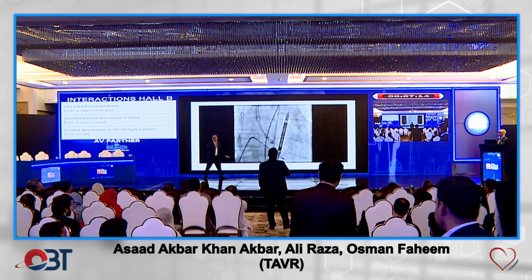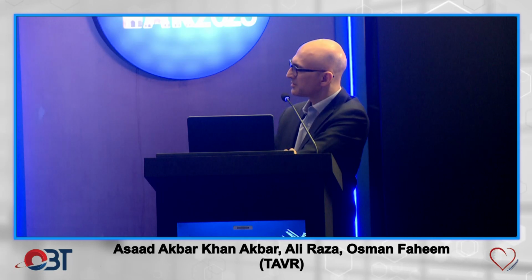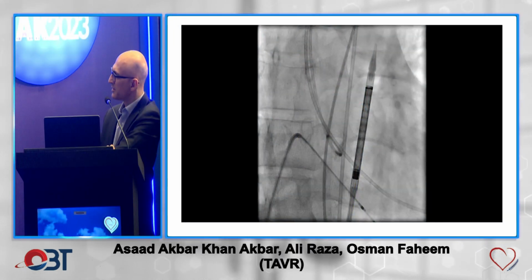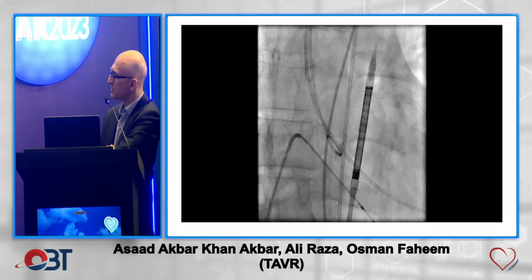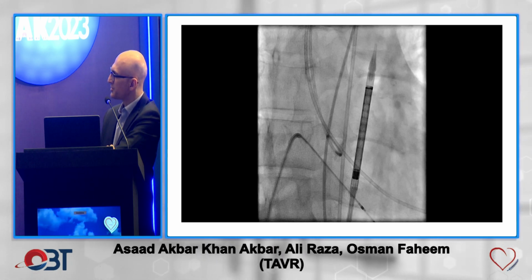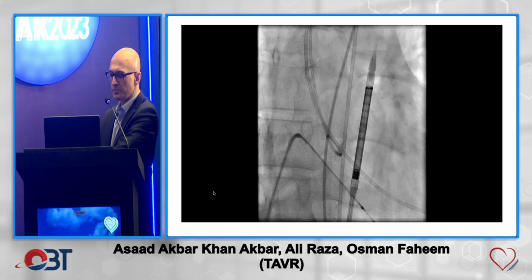I don't know if there is anything additional you guys see. Yeah, basically the paddle should be symmetric, the valve should be symmetric, and there should be no bending of it. Look at the nose cone and make sure the sheath is almost all the way to the nose cone. And then the L-shaped hat, that position you need to keep in mind as you're going up and over with the valve.